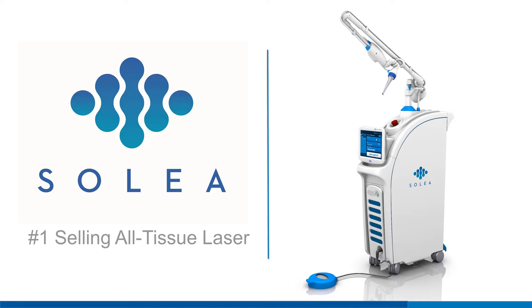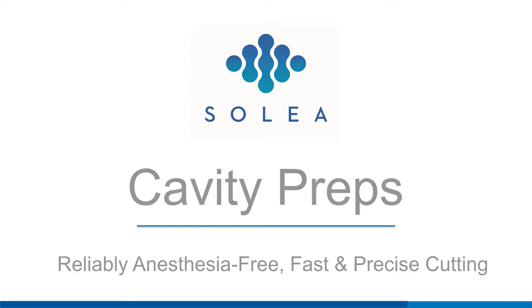Solea is a breakthrough laser technology that delivers an elevated experience for you and your patients. With Solea, cavity preps of all depths and classes can be performed virtually anesthesia and pain-free.